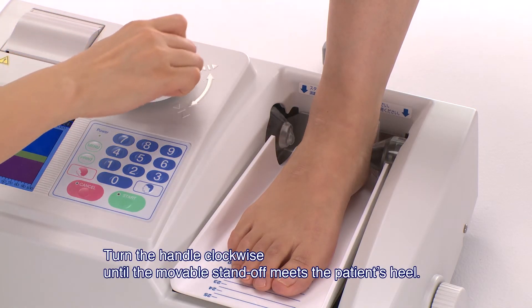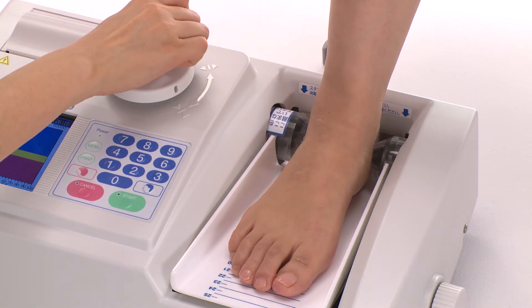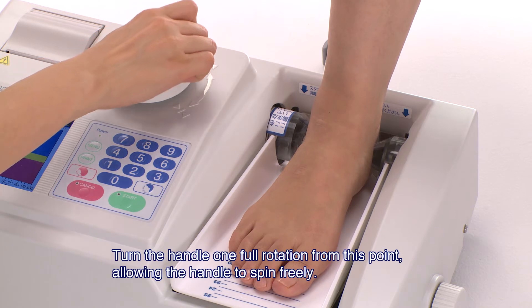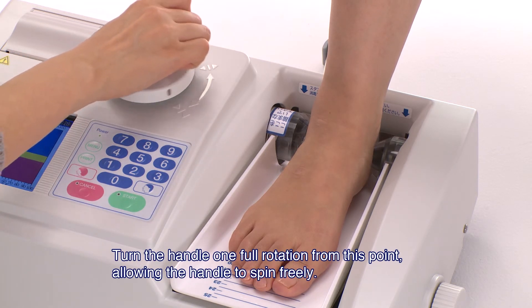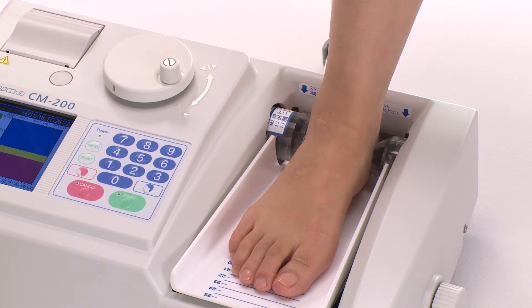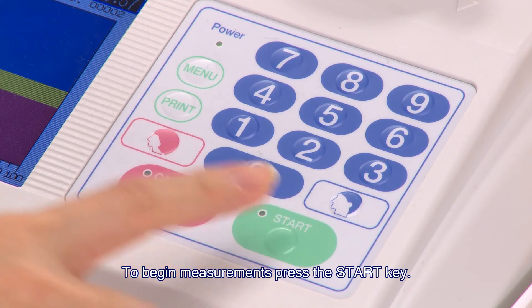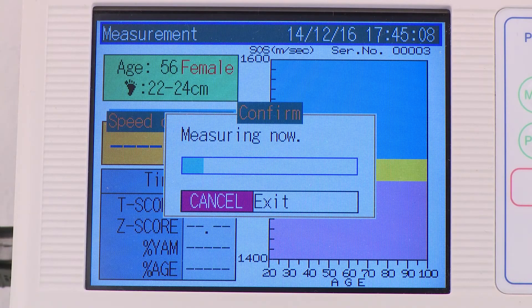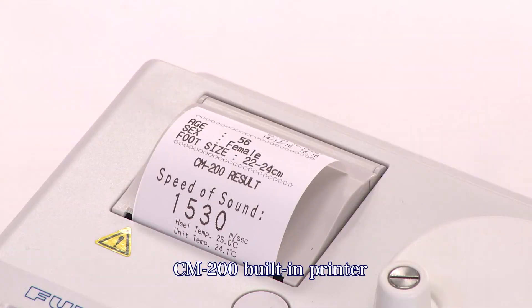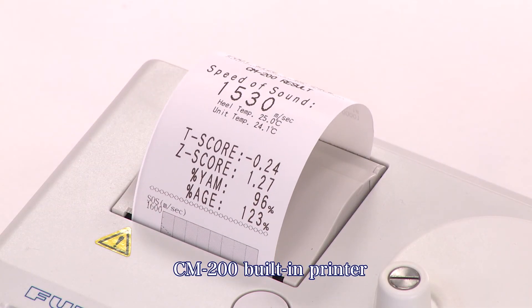Turn the handle clockwise until the movable standoff meets the patient's heel. Turn the handle one full rotation from this point, allowing the handle to spin freely. To begin measurements, press the Start key. After approximately 10 seconds, the screen displays the measurement results and the result is printed. This completes the measurement process.